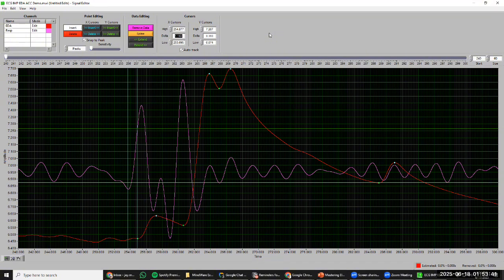So what we should do in these cases is delete that corresponding SCR. We can do that by clicking on the delete function here. And what we're going to do is encapsulate the trough location for that SCR and the peak. Then these effects have been removed from the actual count of how many SCRs are occurring.